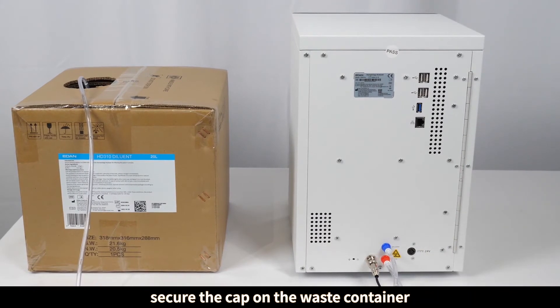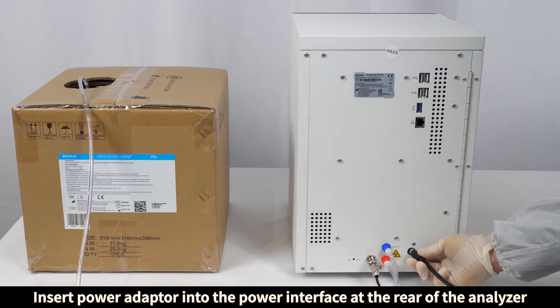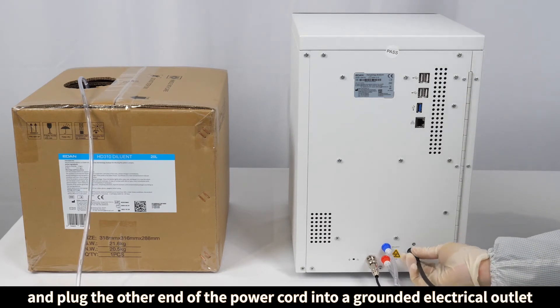Secure the cap on the waste container. Insert the power adapter into the power interface at the rear of the analyzer. Plug one end of the power cord into the power adapter and plug the other end of the power cord into a grounded electrical outlet.